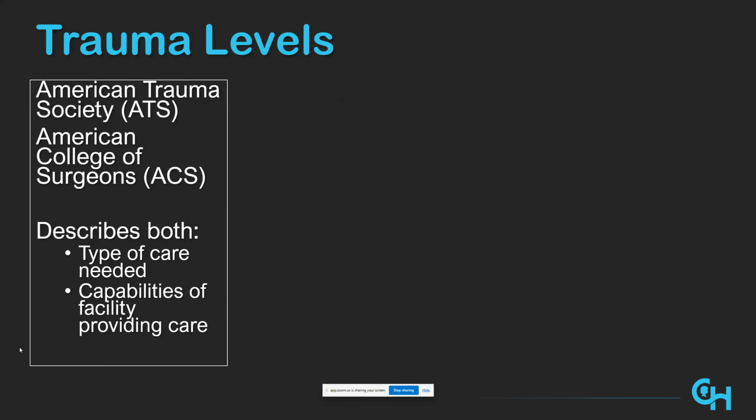I'm going to talk a little bit about how the trauma patients are evaluated before they come to us in radiology. And I realize some of you on this call are much more expert at this than I am. So hopefully I don't lead you astray.